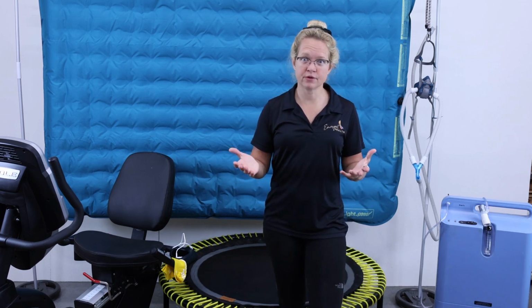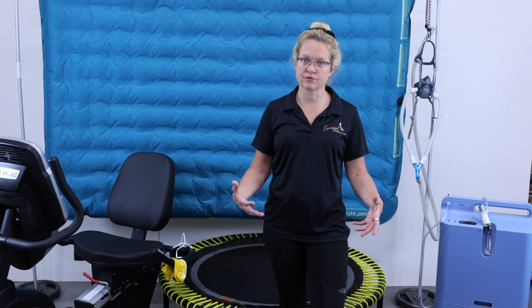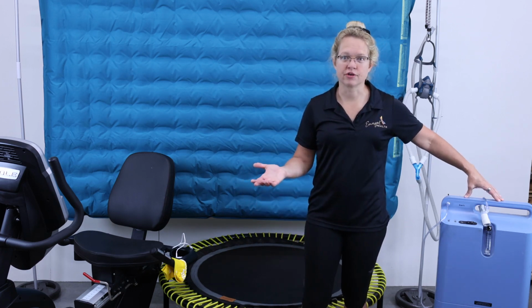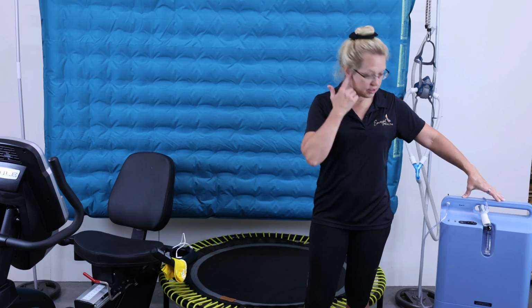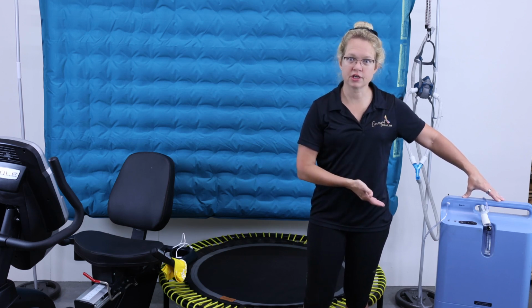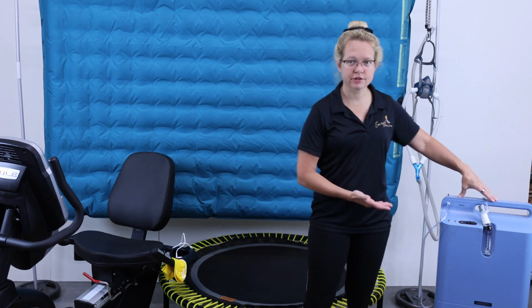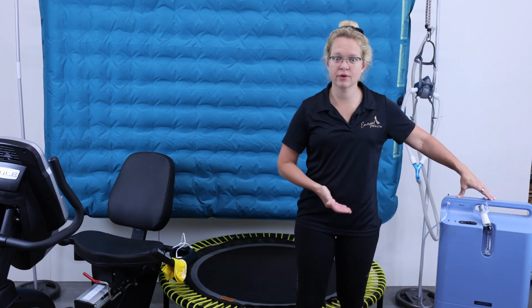Okay, so the next component of the system, once you have your oxygen reservoir bag, is how do you make the concentrated oxygen? So this right here is a typical refurbished oxygen concentrator. You can use any oxygen concentrator. I bought a refurbished one because you can get them a lot less expensive that way.